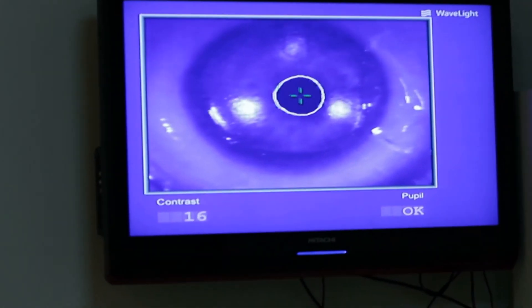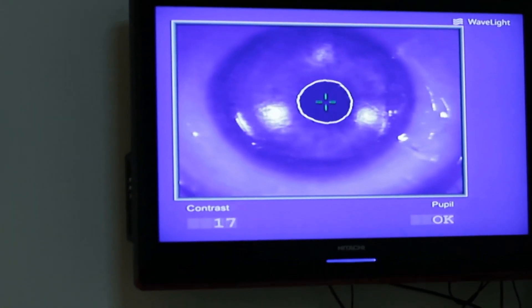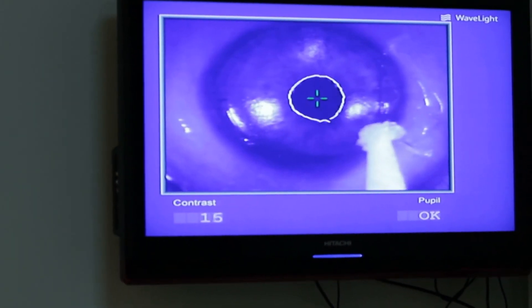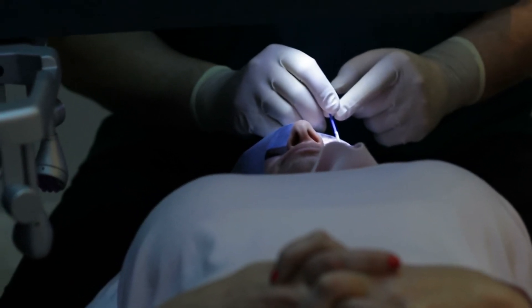The laser treatment is complete. We put the flap very accurately back in its place. How do you feel? I feel okay. That's it. I want some more antibiotics.